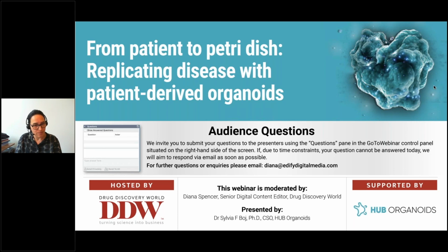Okay, thanks. The next question: what is the source of the fibroblasts used in the co-culture? Are the fibroblasts from the same patient as the organoids? When we started this project, we first just got access to patient-derived fibroblasts that you can purchase from cellular providers, just to optimize the assays. When we saw that this co-culture assay was working, we also developed protocols where we can isolate the fibroblasts from the same patient.